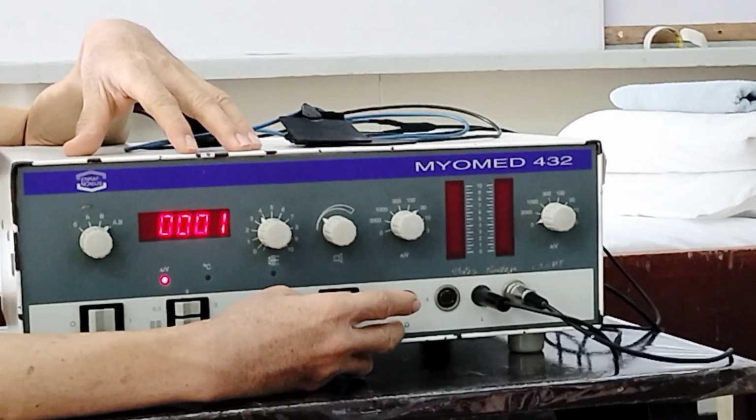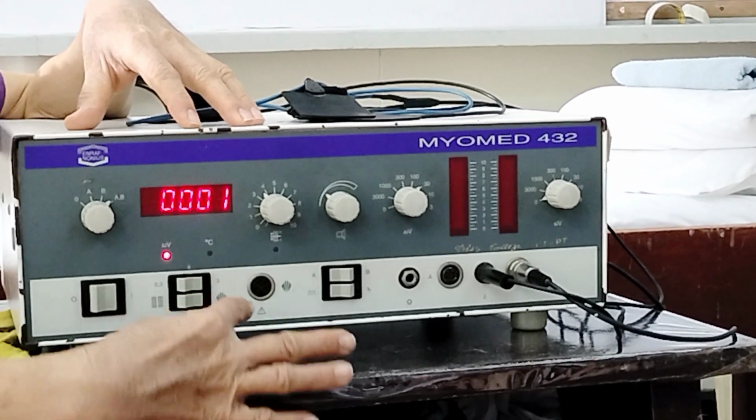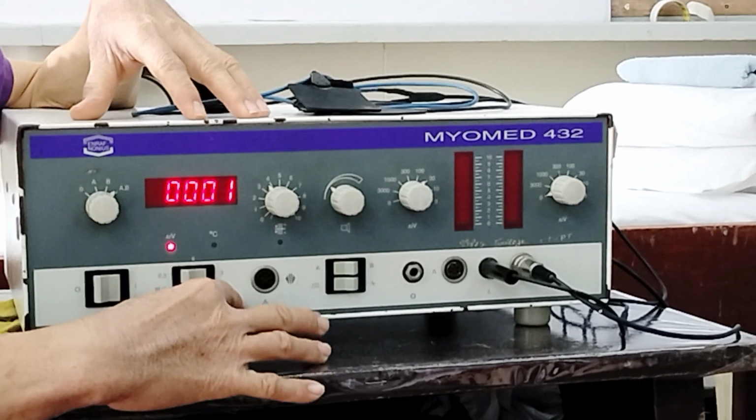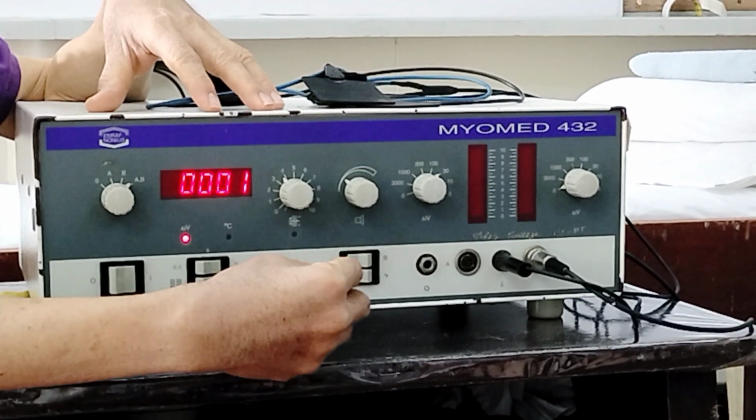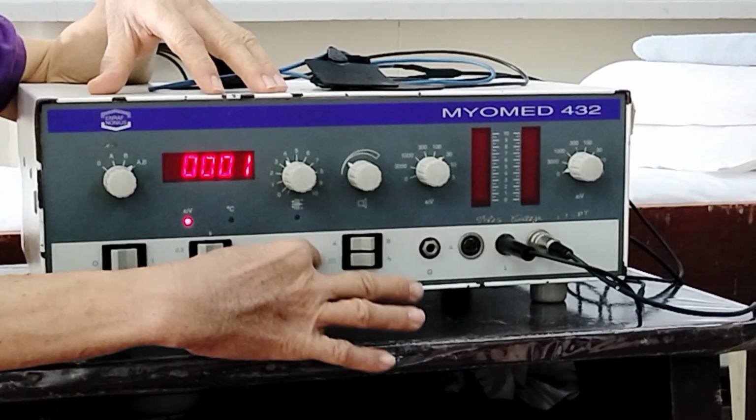If you're going to use this one, you have to attach a monitor to its cable.